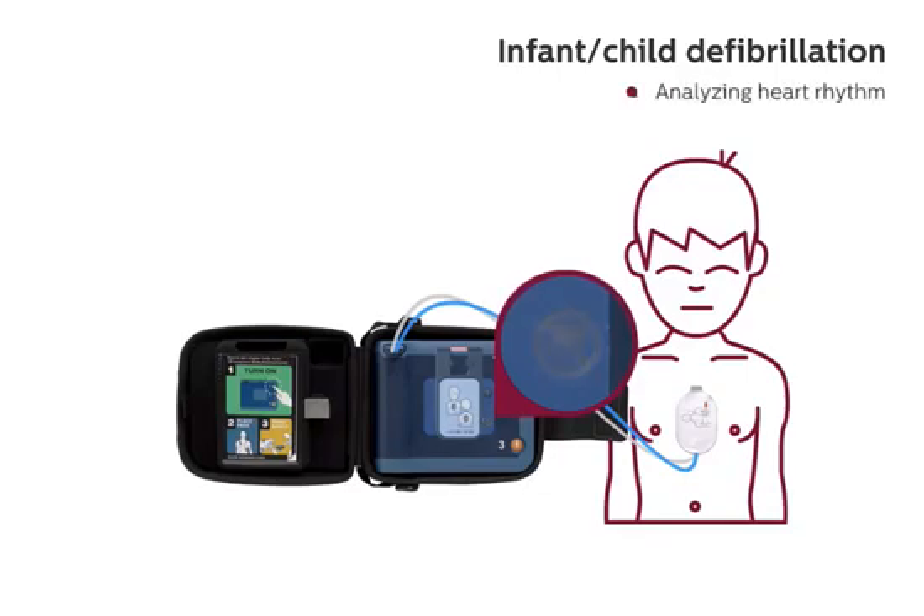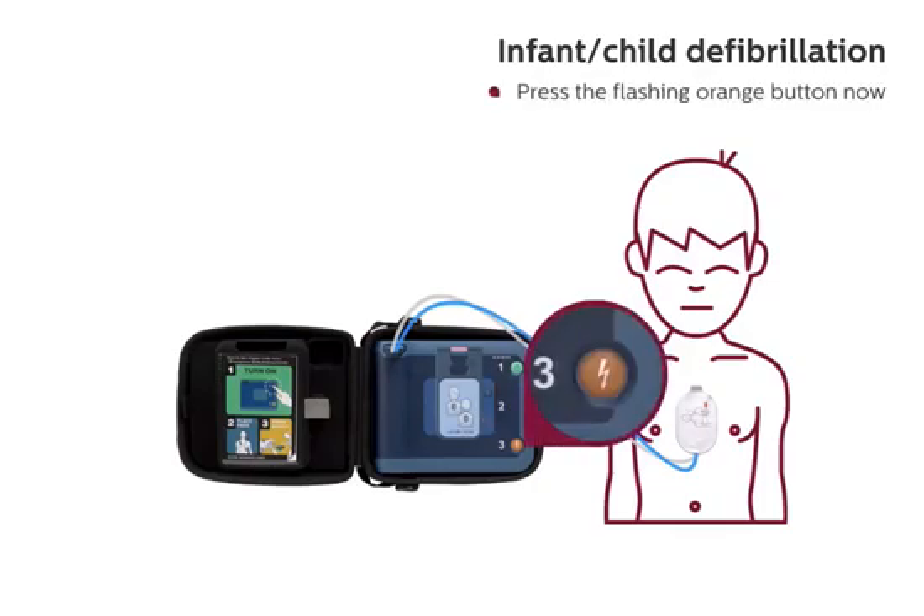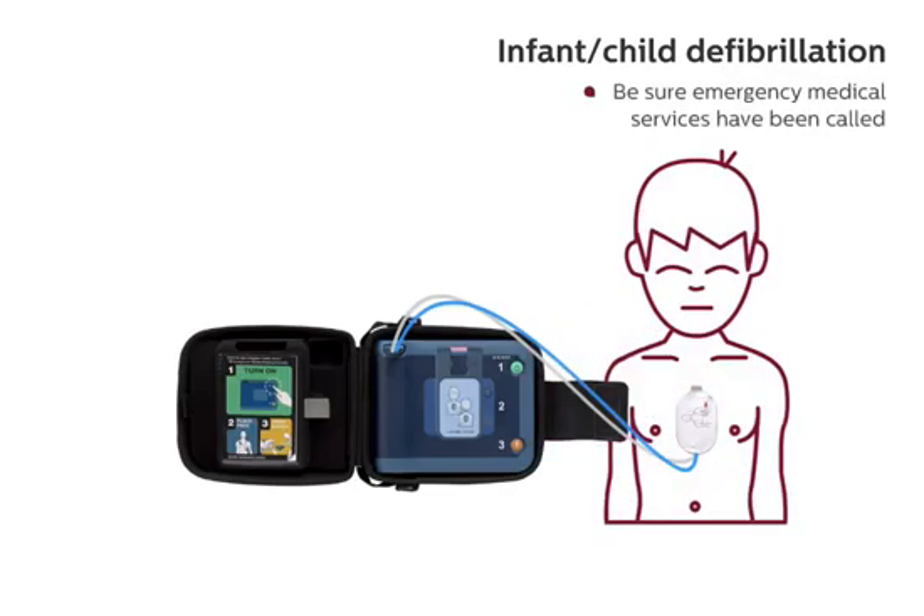Analyzing heart rhythm. Stay clear of patient. Analyzing heart rhythm. Shock advised. Stay clear of patient. Press the flashing orange button now. Deliver shock now. Shock delivered. Be sure emergency medical services have been called.